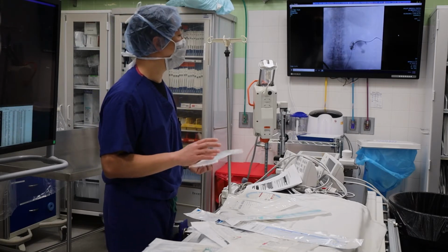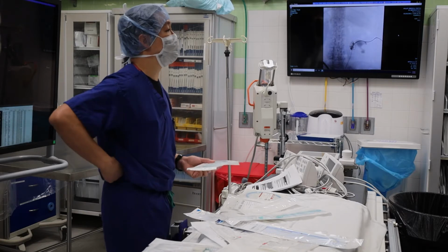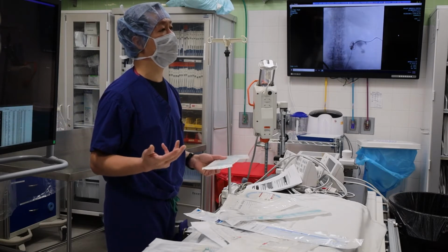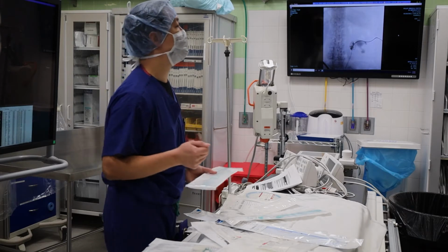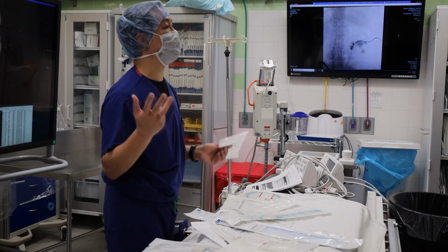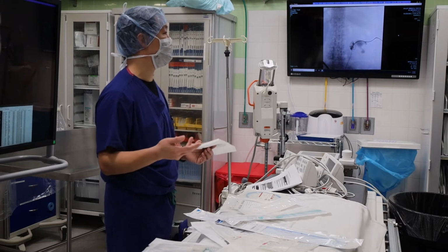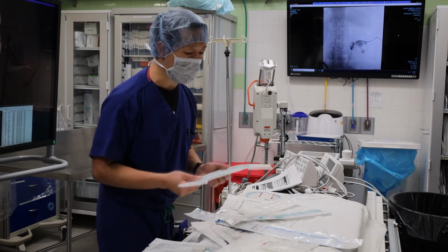Ask your doc. Don't assume, because there have been patients who come back to our clinic and they have an ulcer in their back because the 3-way has been rubbing them. Or they call us in the middle of the night, my tube's not making urine, come to the ER, and 8 hours later we go see them, they turn it off. Not uncommon. Or it's leaking, there's something wrong with the tube, and that's because they were messing with it and they unscrewed it. So every time we put something on, it's a point of potential failure, right? Something wrong can happen. Good, gravity bag. Okay, good.